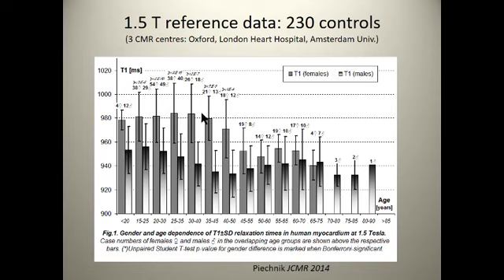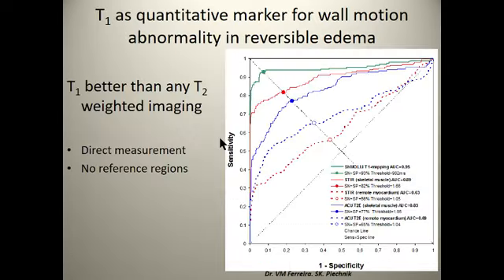So women, premenopausal women, have longer T1s, but the numbers we get are very tight. So there's some quite interesting tight numbers you can get out of these sort of data. And it works across centres. It's the same everywhere. It just kind of works.